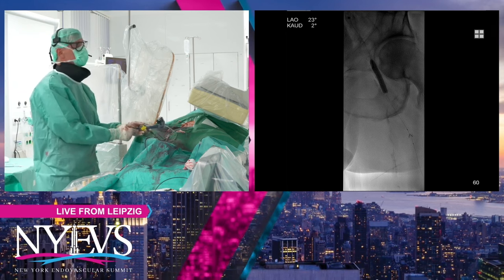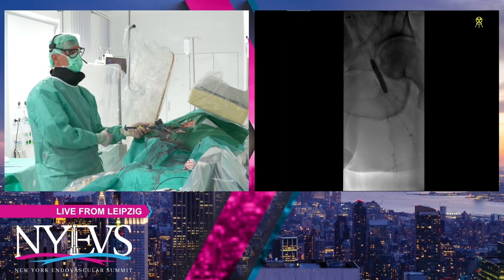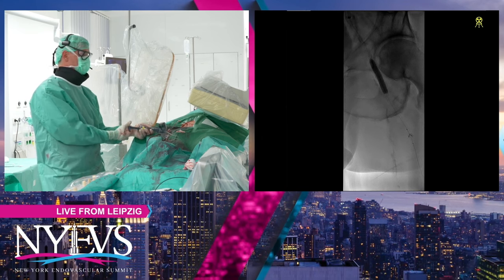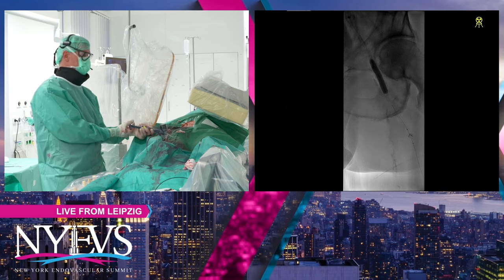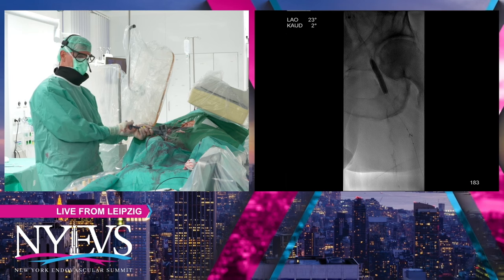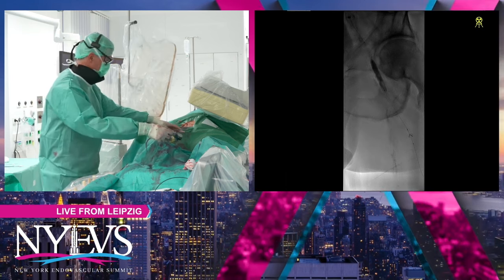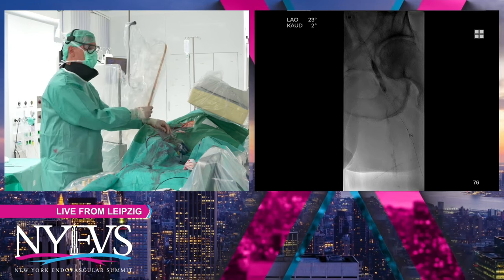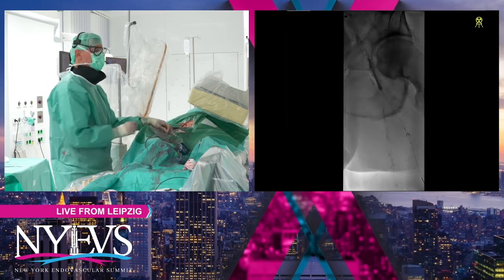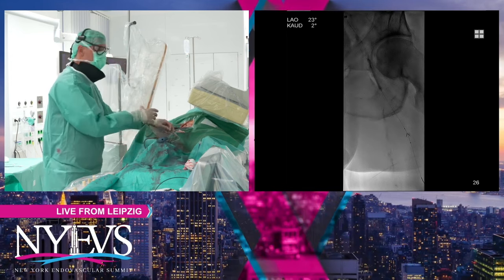Just curious, Andre, why did you choose the EmboShield versus the NAV6? Yeah, the Spider. Oh, Spider, I'm sorry. This is NAV6 here. Yeah, I prefer NAV6 here together with the Jetstream. I have the impression that it runs smoother over that NAV6 wire, the long wire exchanged to that one, somehow better than the Spider wire. Yes, that has always been our experience.